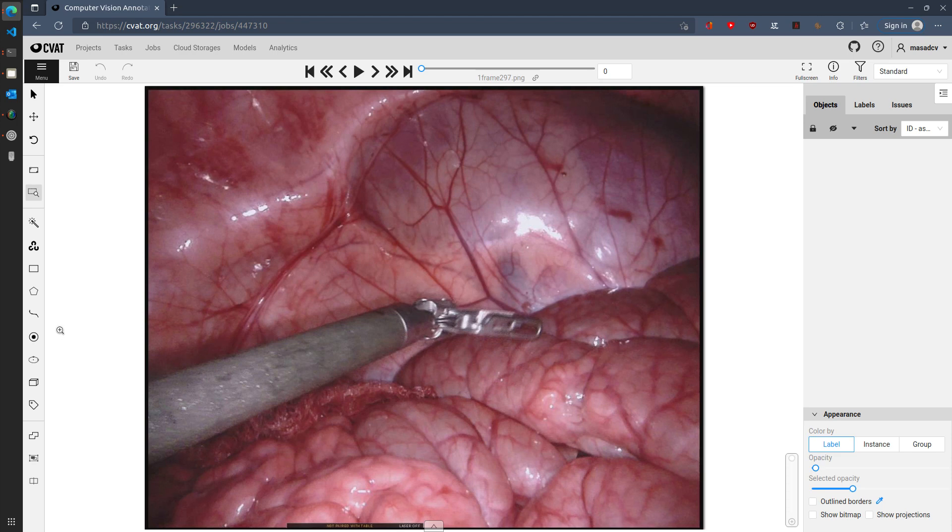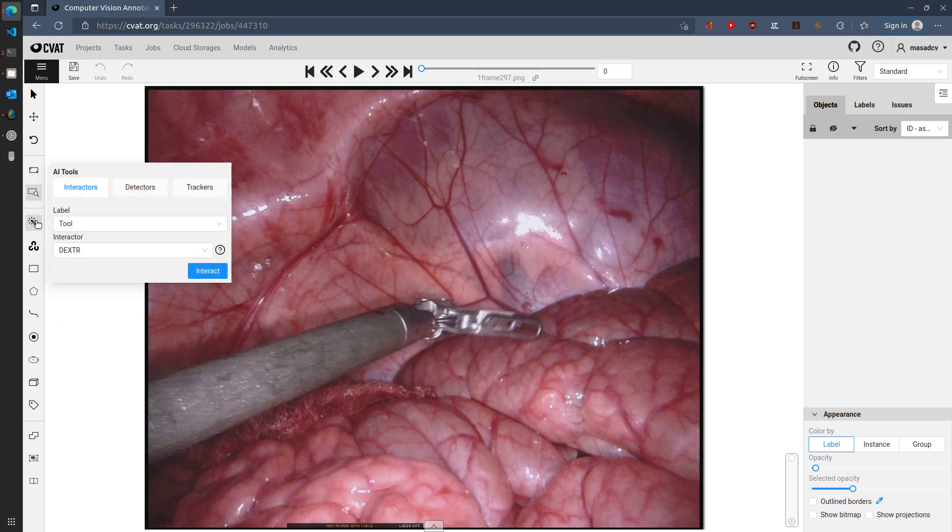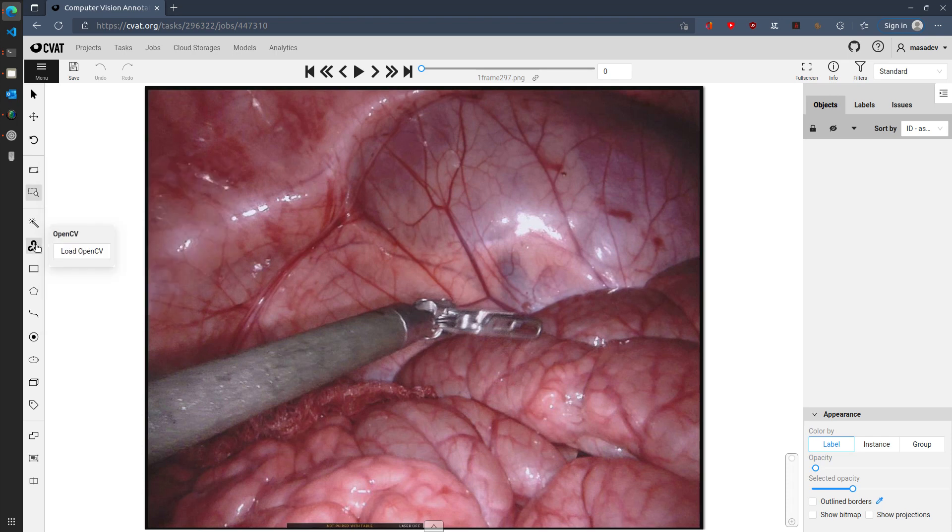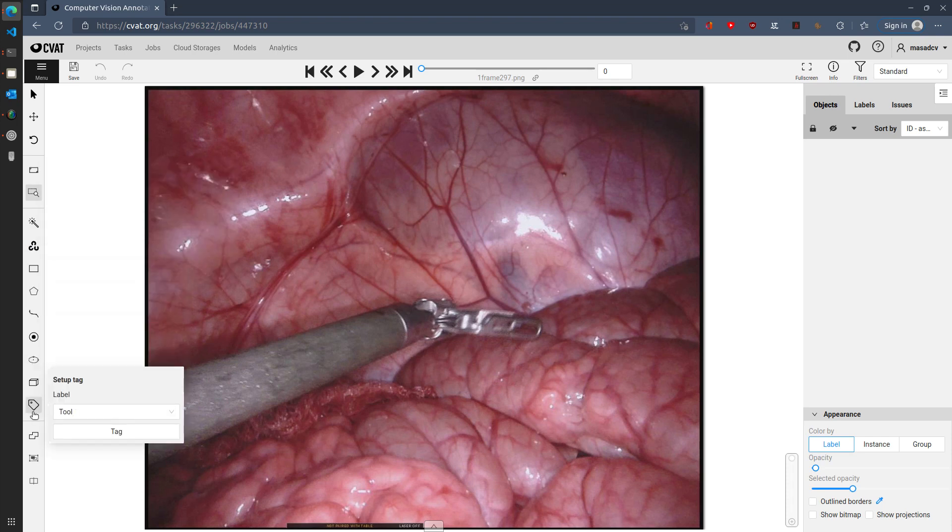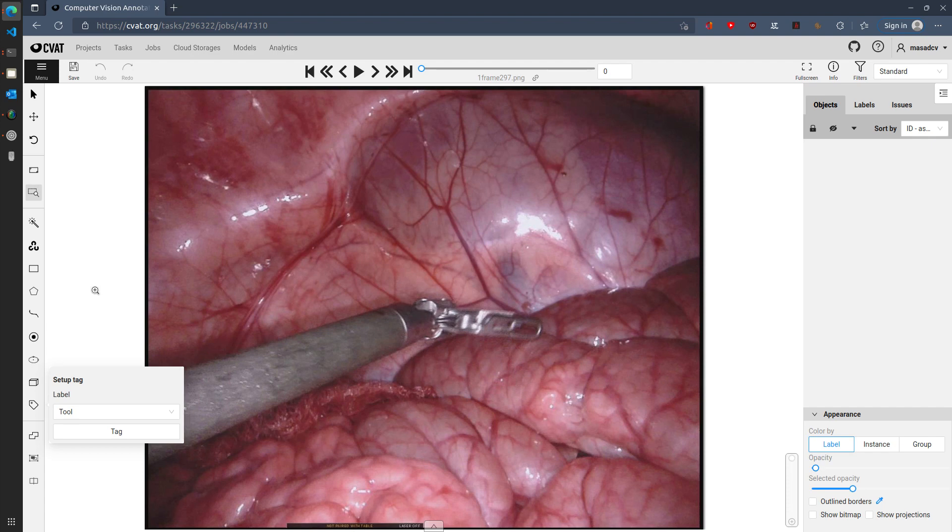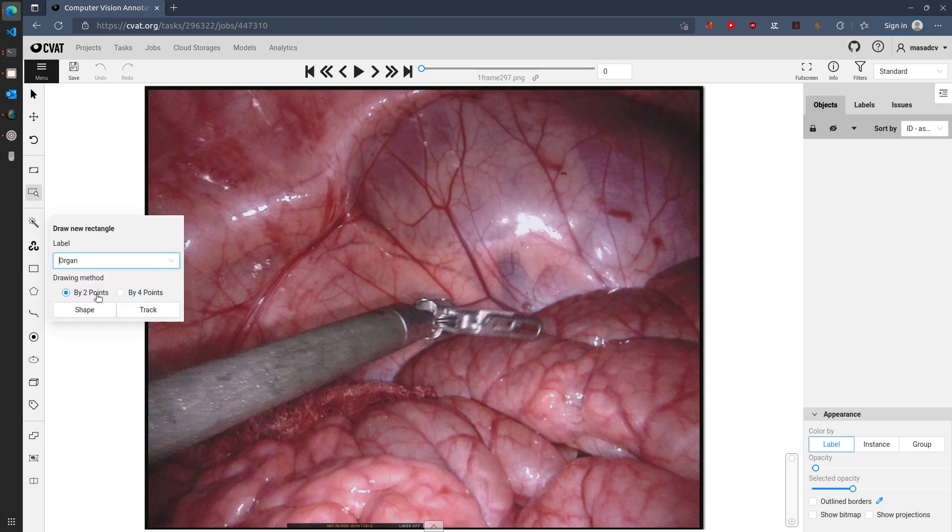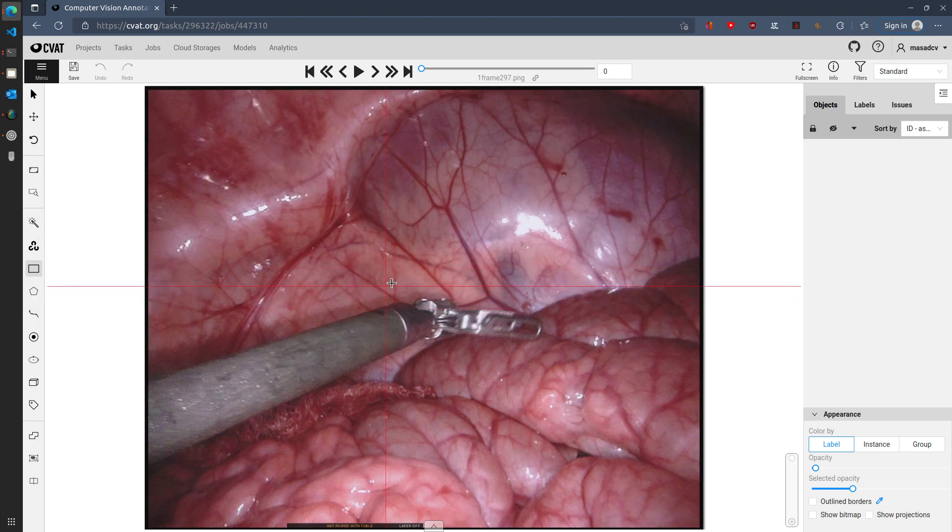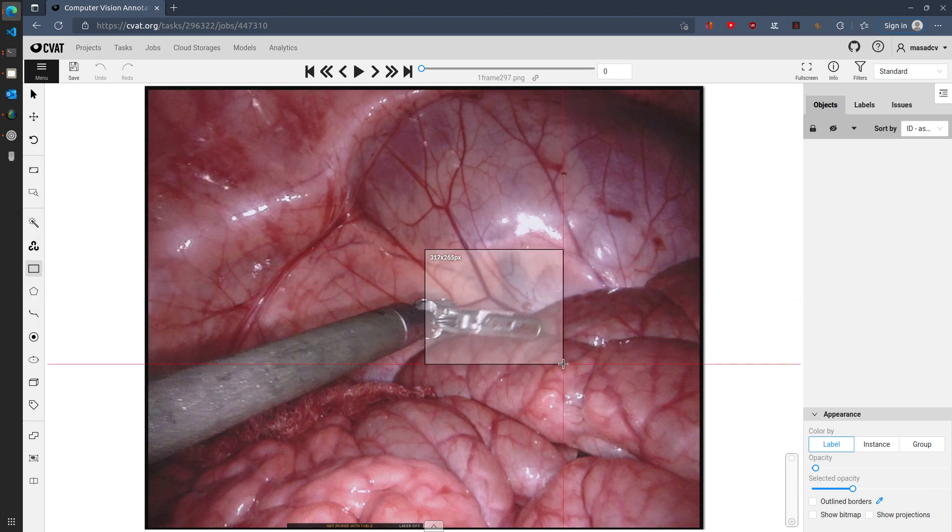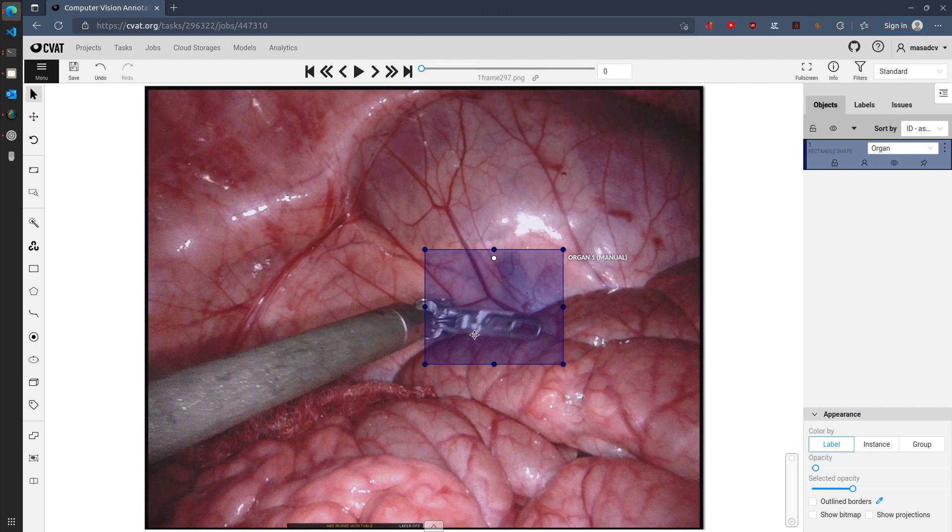In terms of the different annotations, you can provide AI based automatic annotations, you can use smart brush using OpenCV, or you can provide different shapes corresponding to the different objects in your image. So for example, if you want to add a rectangular shape, you can select the rectangle tool, then you can select the label that you want this for. And then you can select shape to activate the tool. You can then click through the image to provide the tool in place where you want it.